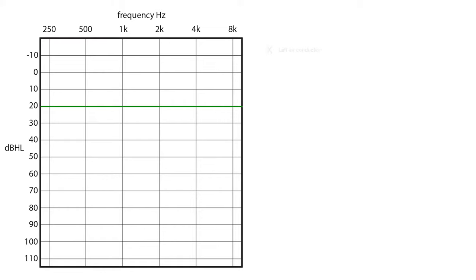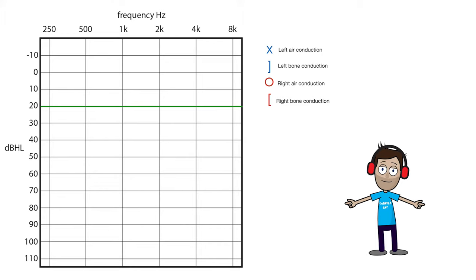With this patient we'll test the right ear first. Starting at a frequency of 1000 hertz, a noise is played that the patient can hear comfortably. The intensity is lowered in 10 decibel steps until they can no longer hear it. Once they can't hear it, the volume is adjusted up and down in 5 decibel steps until a threshold that the patient hears 50% of the time is reached.